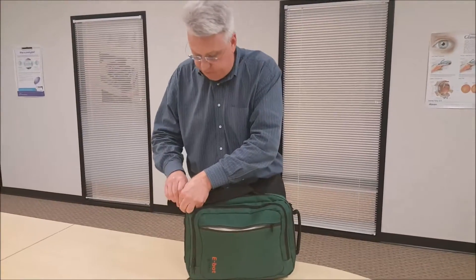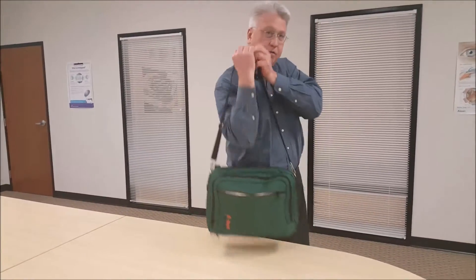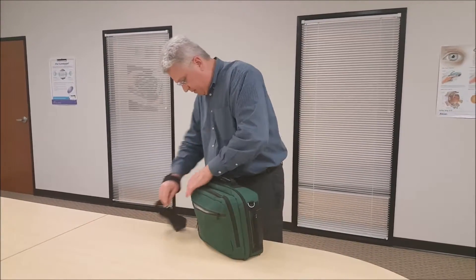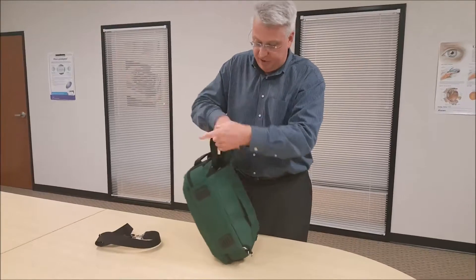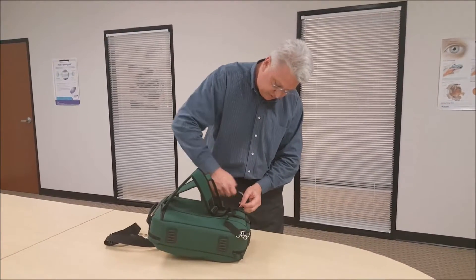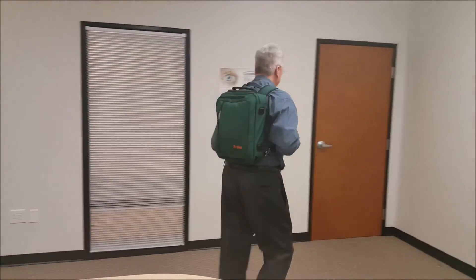Pull the shoulder strap out of the front pouch, attach it, and put it over your shoulder. The final way to carry your E-Bot is by pulling the backpack straps out of the back and fastening them to the clips. That's how we transport our E-Bots, and that concludes our video on unboxing the E-Bot and packing the backpack.